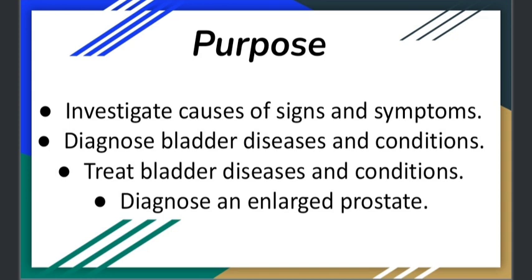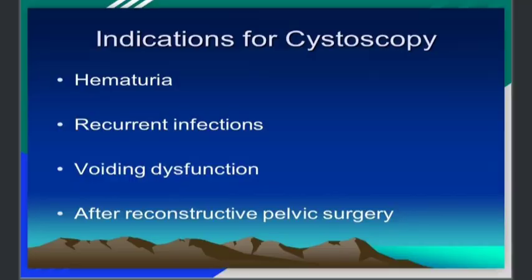Second is to diagnose bladder diseases and conditions. Third, to treat bladder diseases and conditions. Fourth is to diagnose an enlarged prostate. Now let's see the indications. There are 4 indications for cystoscopy.